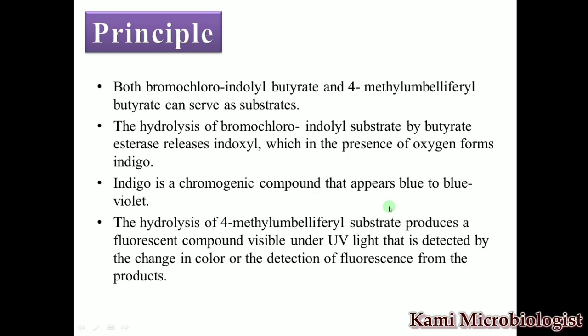After this, we have to examine the hydrolysis of the methylumbelliferyl substrate, which produces fluorescence under UV light, and we mostly detect it under UV light. In this way we get the fluorescence of this color. That's how we can detect the blue to blue-violet color in this case.